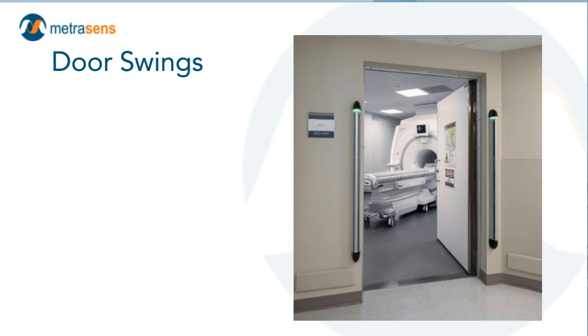Hospital building codes have really frowned on latchless doors. Code officials really want doors that close and stay closed because they're beneficial in reducing the spread of smoke and fire if the building catches on fire. So latchless radio frequency doors are fewer and fewer, and doors that positively latch are more and more.